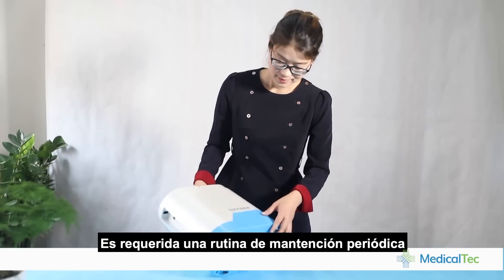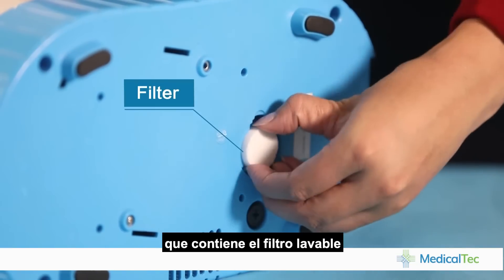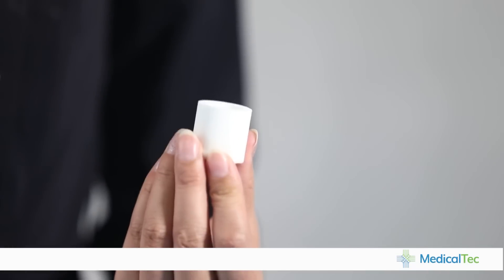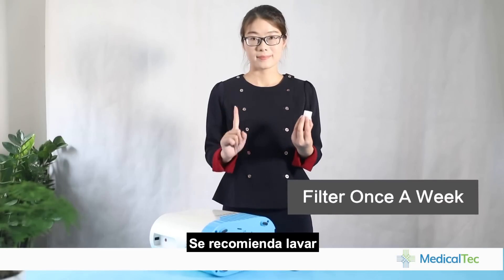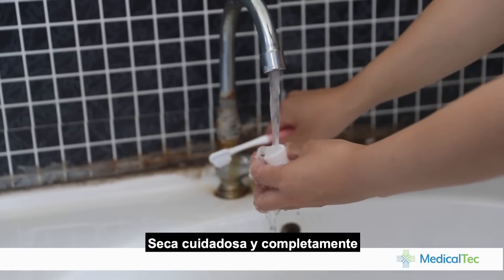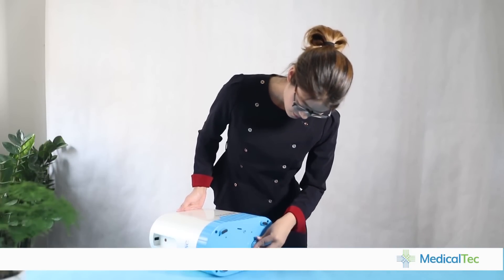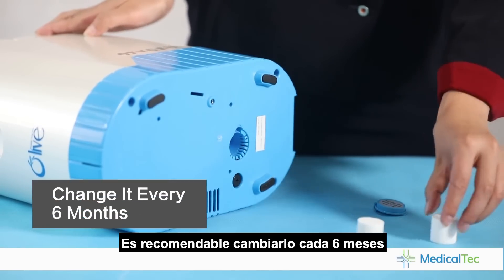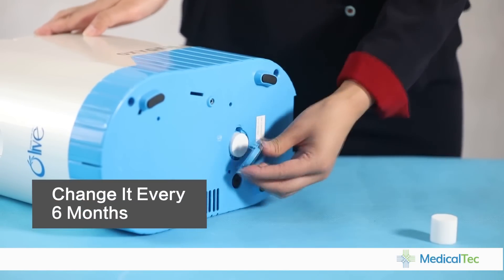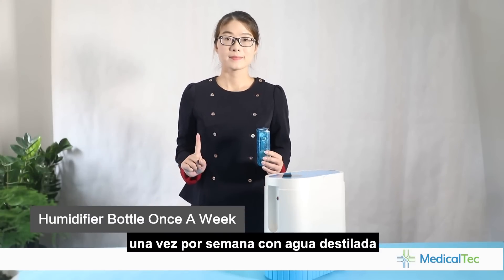Periodic routine maintenance is required. There is a filter door containing the washable filter. It is recommended to wash the filter once a week with clean water. Be sure to thoroughly dry the filter before replacing it, and it is suggested to change the filter every 6 months. Please also clean the humidifier bottle once a week with clean water.